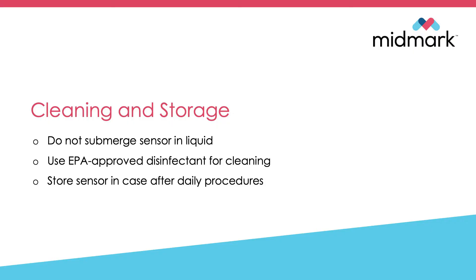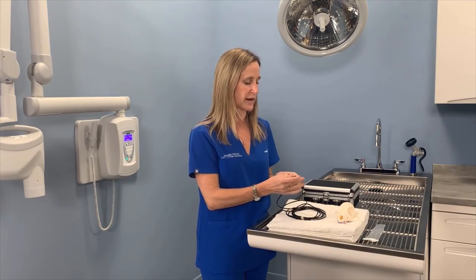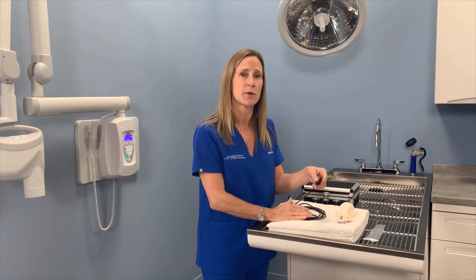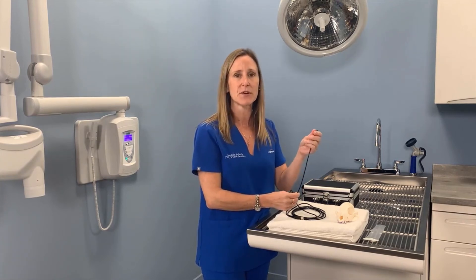Cleaning and storing your sensor: when the procedure is over, you can remove your sensor sheath covering. If you need to clean the sensor, you don't want to dunk it in a solution overnight. It is waterproof, but the correct way to clean it is to use an EPA approved disinfectant and wipe the sensor and the cabling down.